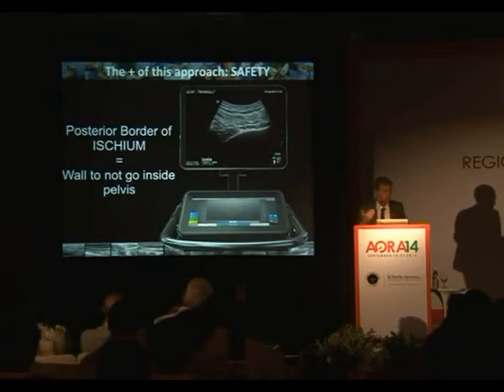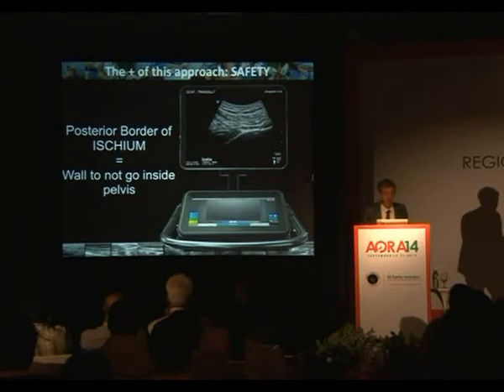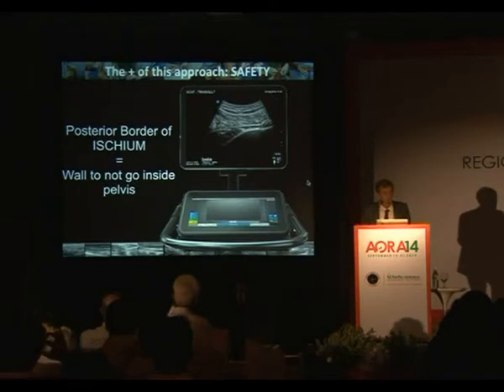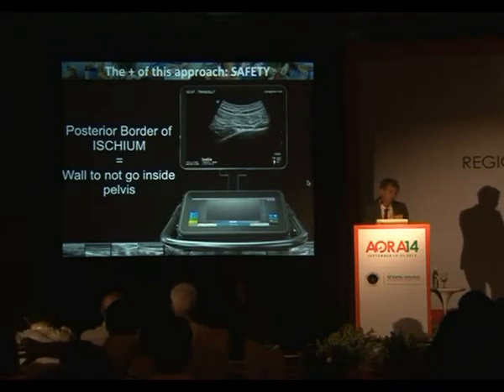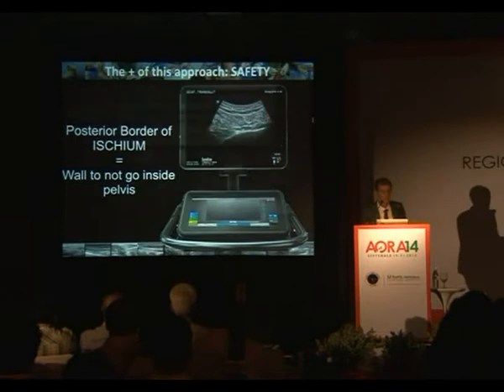I want to make this approach extremely safe to be used by a junior or by a senior. All the parasacral approaches that I can read about or that I was performing previously were difficult, so they were reserved for senior anesthesiologists. This can really be done by a junior anesthesiologist if he's able to follow the needle.